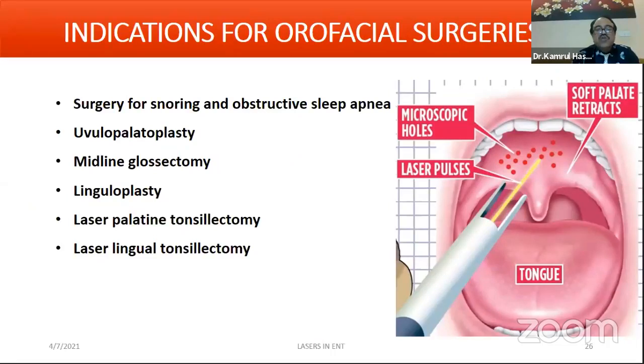So what are the indications for the surgeries? As we know, the cavities other than the oropharynx, the laryngopharynx, have a very vascular mucosa, so we can work mainly on the soft tissues. With the carbon dioxide laser, when we cut the tissue by a beam, now with the scanner mode attached with a joystick, by pointing the joystick we can narrow the beam to a small pinpoint, cutting with a smaller edge, and controlling which area we are cutting and how much we have to cut.